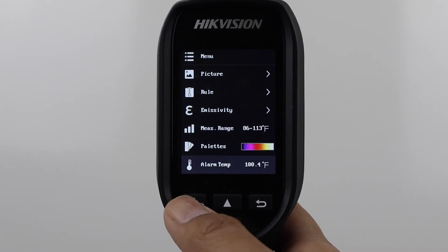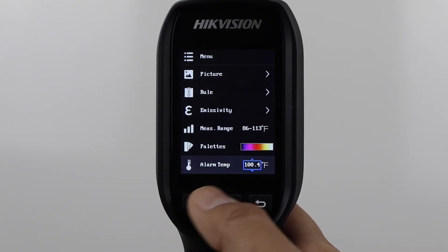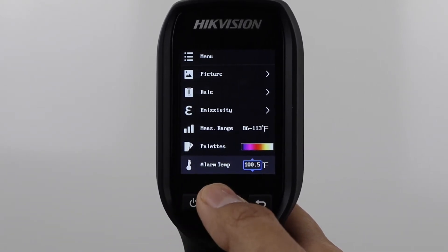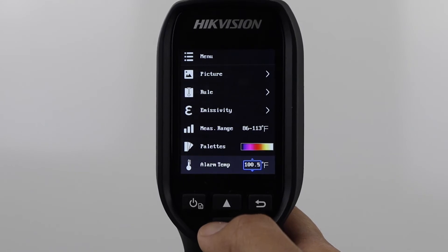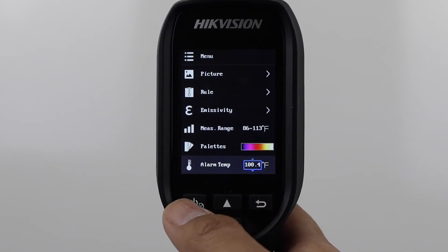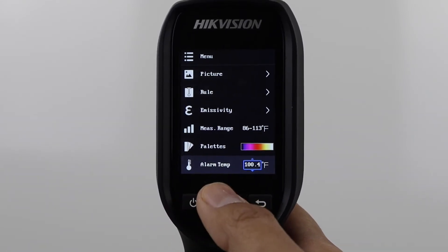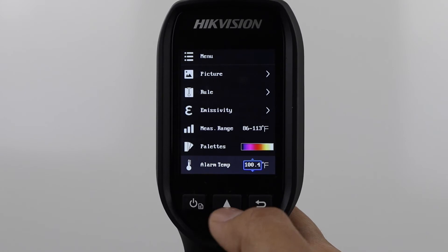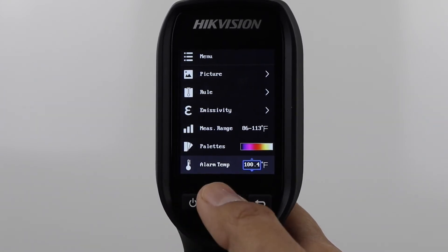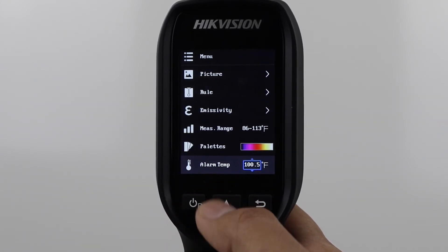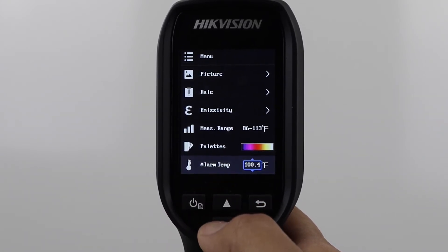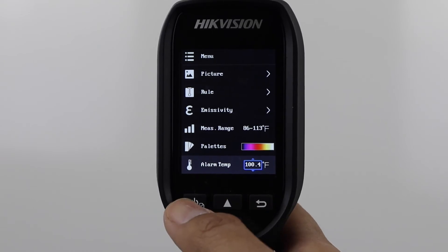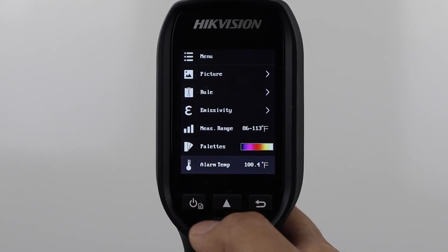Alarm Temp lets you set a custom temperature alarm threshold which will alert you whenever a subject has a body temperature above the set limit. Press the menu button and use the arrow keys to adjust this setting, then press menu again to lock it in.